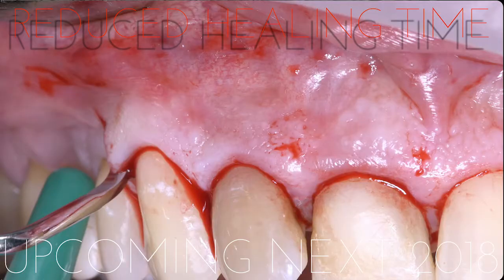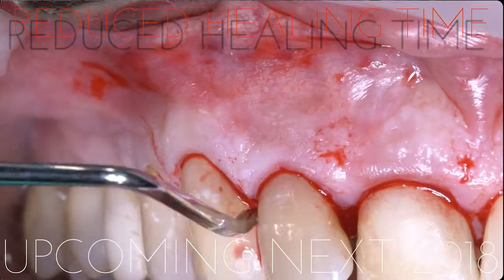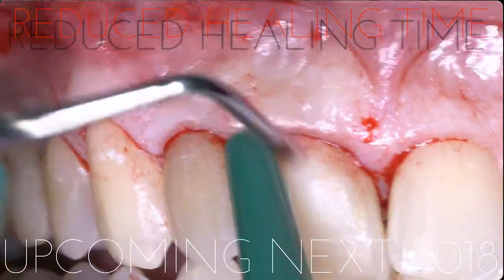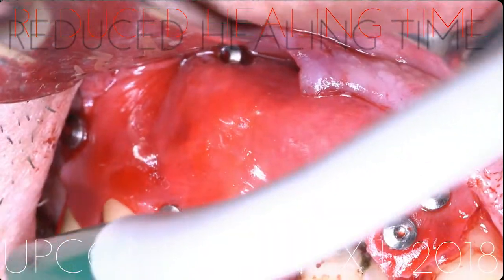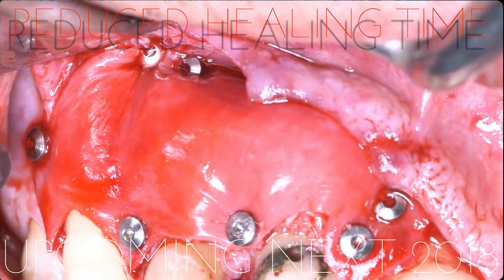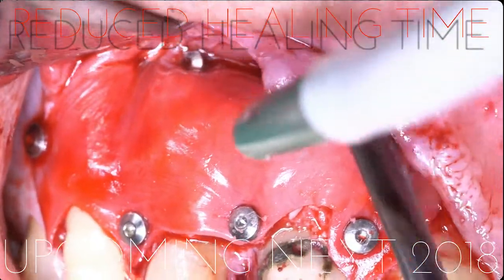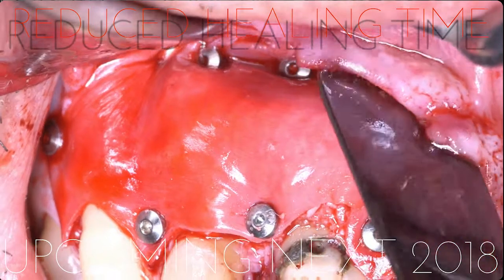We changed completely the protocol. Of course, we had to do endo retreatment, even on this case where the tooth was going to be extracted. I did guided bone regeneration prior to tooth extraction. Of course, I don't have to have any kind of infection. Again, the same technique, the same approach, minimally invasive. By using resorbable collagen membrane, there is no risk of exposure. So we also reduce the risk of complication in guided bone regeneration. And that's a pretty big graft on this patient before extracting the tooth.